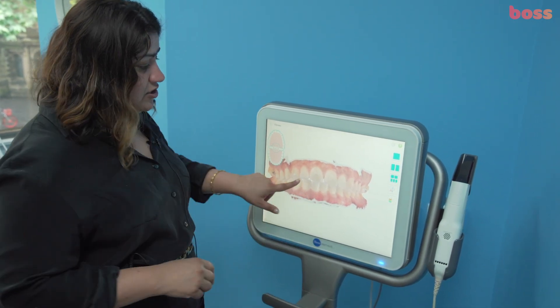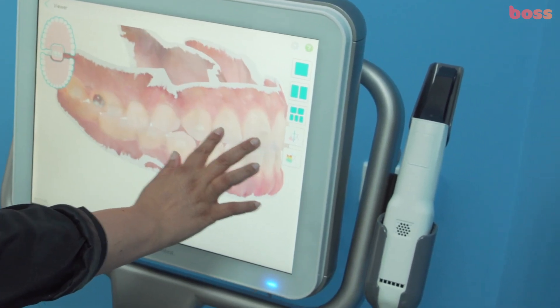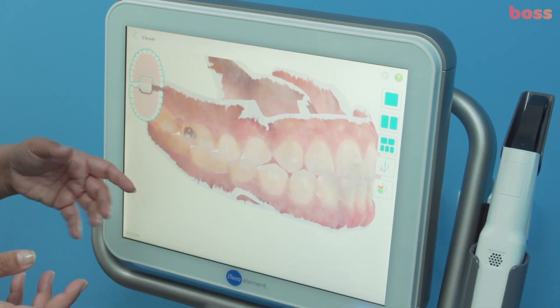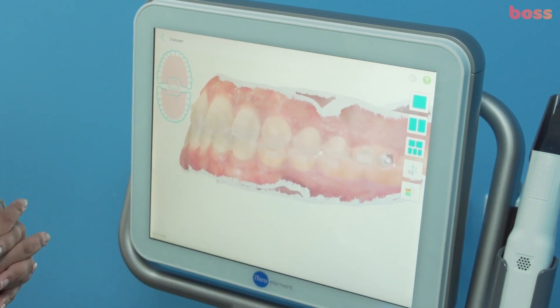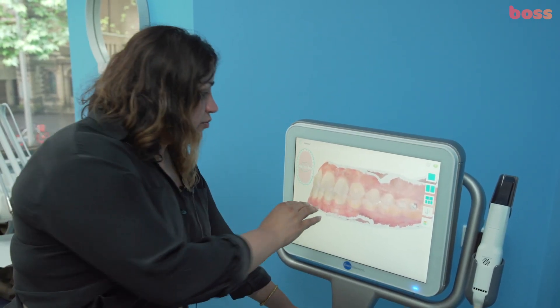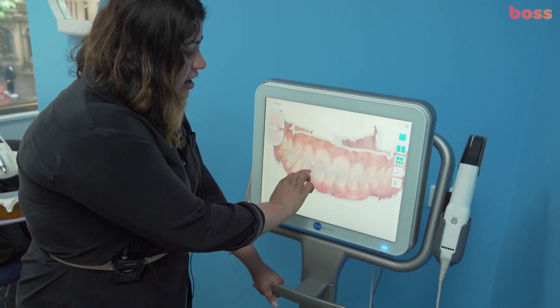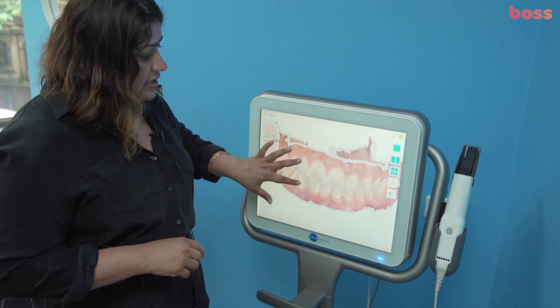We've done some IPR today while she's here so we can post the aligners. On one side it's quite close to class 1, so we're going to have her wear just a light holding elastic at night — I like the Fox elastic from OMCO for that. On the other side there's a much more significant class 3, and it's significant enough that we can't fully correct it without extraction, but we can improve it. We'll try a heavier elastic like a rabbit elastic on that side. A bit more IPR here to continue alleviating crowding.